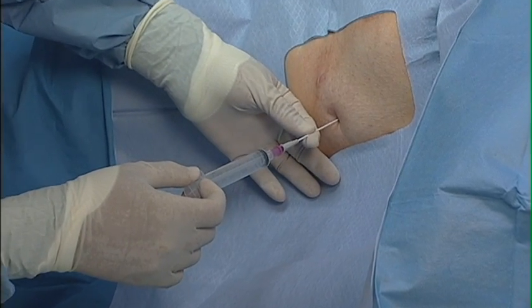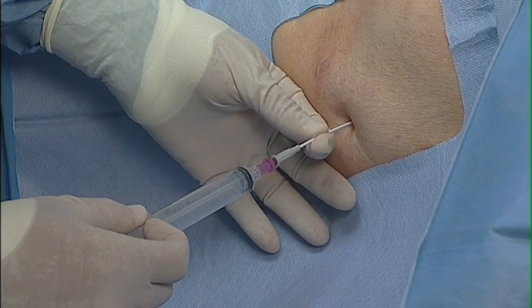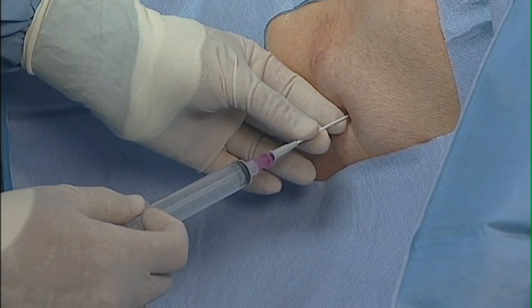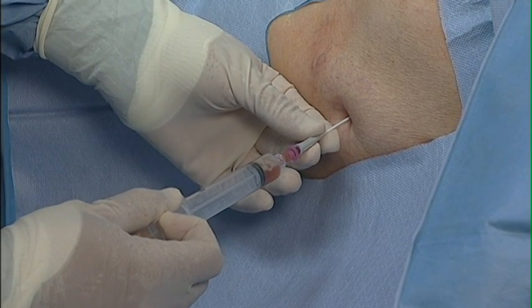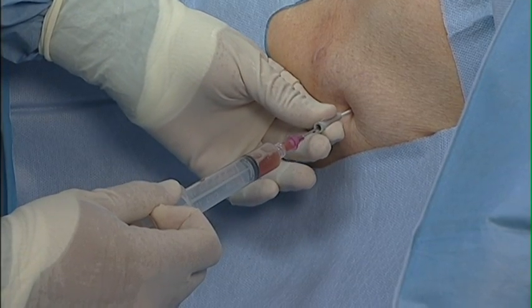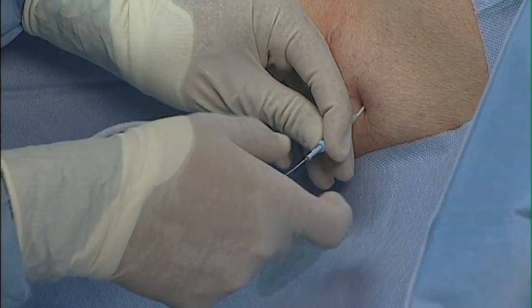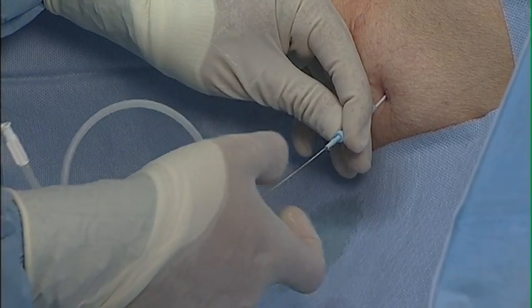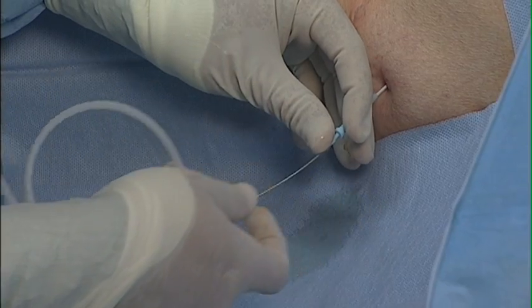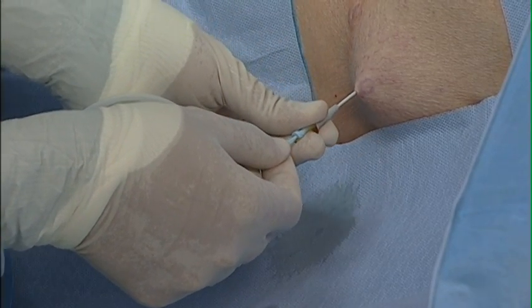Advance the guide wire introducer with needle attached to a small syringe through the desired interspace just over the lower rib. Aspirate with the syringe to ensure the free flow of pleural fluid. Remove the needle and syringe, leaving the guide wire introducer in place. Advance a guide wire through the introducer into the pleural cavity. Remove the introducer, leaving the guide wire in place.